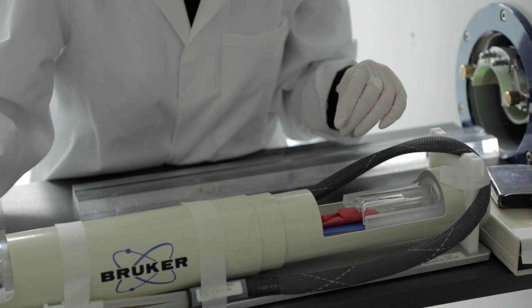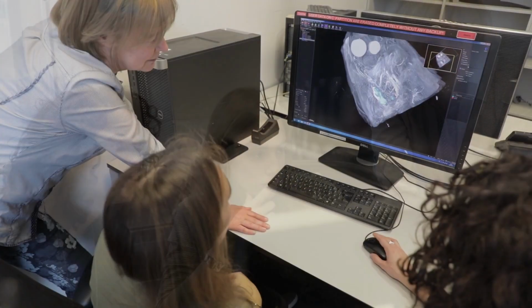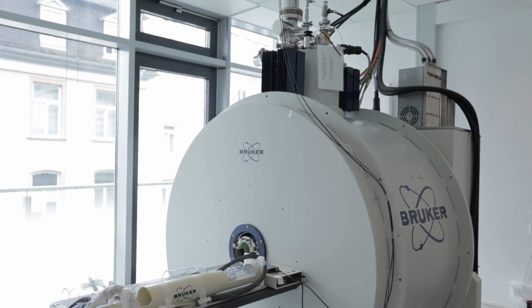So we needed other different imaging techniques like the MRI and the microCT to try to understand how this structure is beating in a beating heart, for example with MRI, on how is the morphology of the structure more with the microCT. And the advantage of this was also that with the microCT we didn't need to extract the heart of the fish from the entire fish, and so we could actually image the outflow tract and also the connecting vessels of the fish without the need of destroying them or losing them during the dissection.